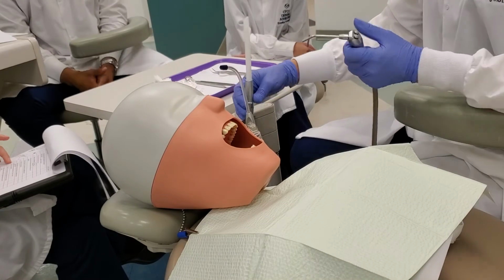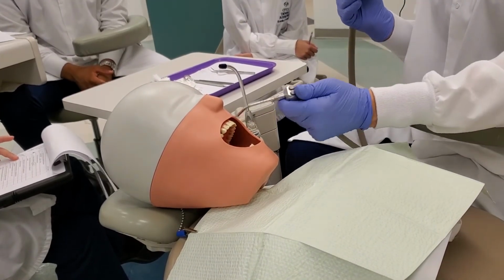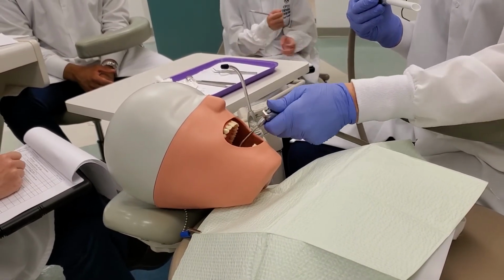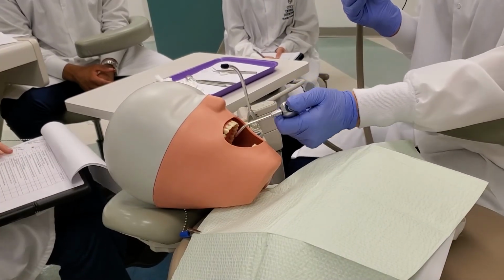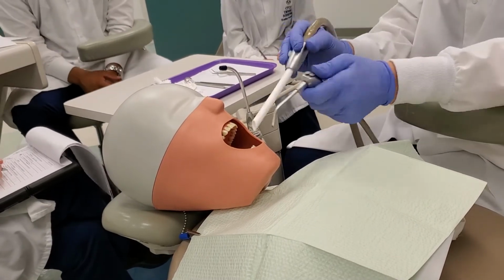So when you're doing a limited rinsing technique, that means usually if it's limited, it's just a quadrant. You're just going to go from the posterior to the midline and back, okay? Posterior to the midline and back. Or if you're working on the anterior, whatever. But you don't have to do a full mouth rinse, okay? Unless you have debris everywhere.